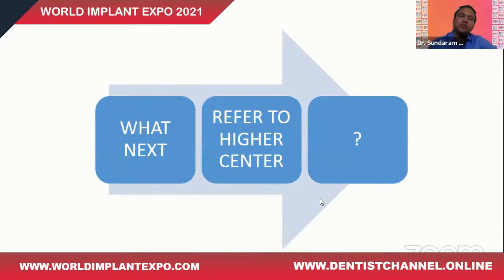Now, so far we had been looking into all the inconsistencies a radiograph can cause. Because the conventional intraoral and panoramic radiographs can provide only anatomical information in a two-dimensional way, but we are talking about something known as implant dentistry, where it is all about precision. You want the implant to be placed in a 3D space, which is surrounded by bone in all the dimensions. And of course, we also have to respect the anatomical barriers like the incisive canal, the mental foramen, the inferior alveolar canal, the maxillary sinus. So what do we do then?